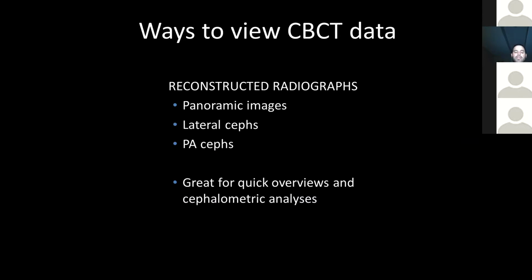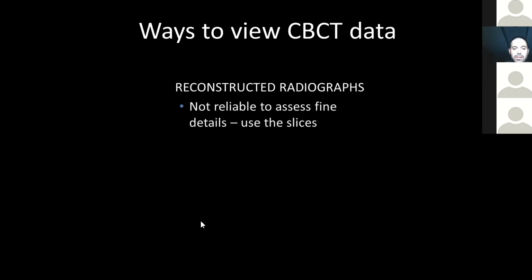I really believe that dentists love panoramic radiographs because you get all the teeth and the supporting structures in one view. You can leave it up on a monitor in your operatory and have basically a roadmap for your patient's dental presentation. It's extremely convenient. And that is why commonly, 100% of the time in my case, I reconstruct a pan from every single cone beam CT scan. Okay, it lets me use it as a roadmap to evaluate tooth by tooth. So let's talk about that, kind of the strengths and weaknesses here.